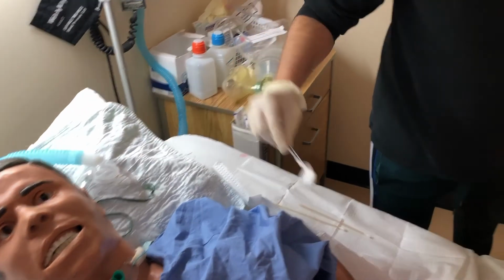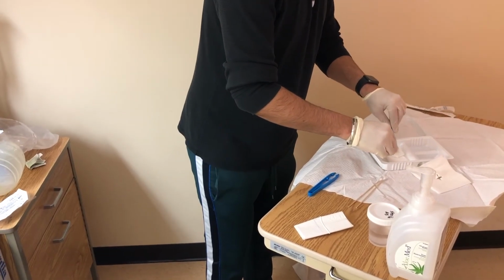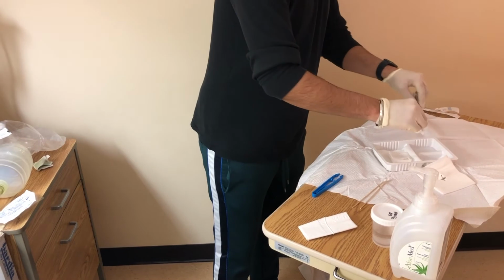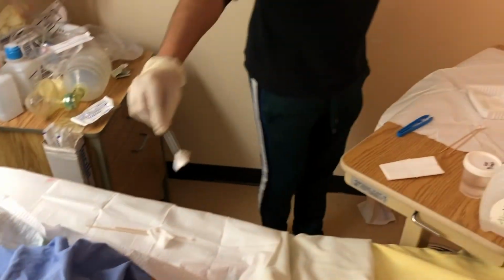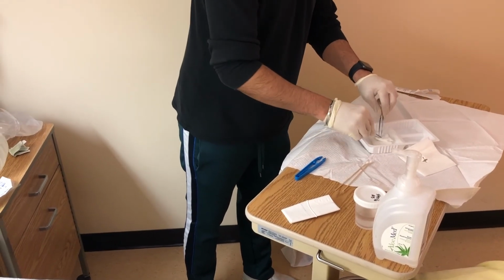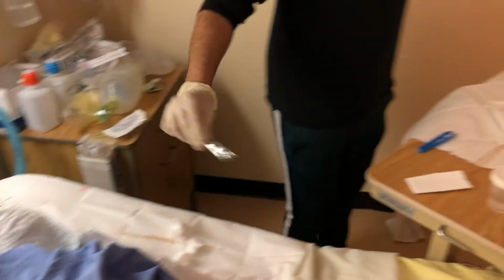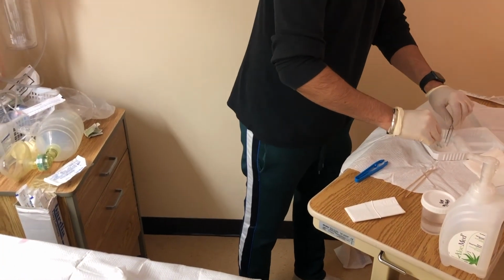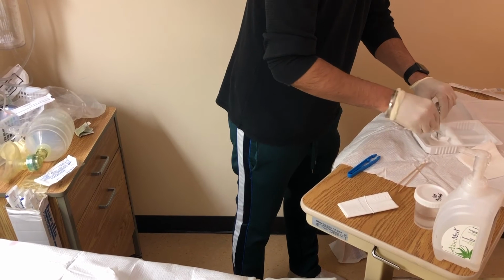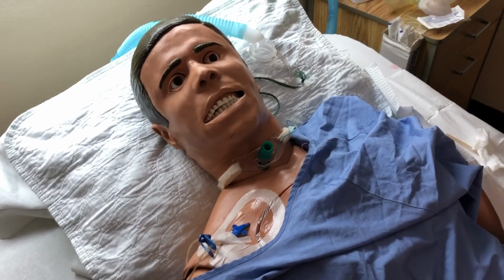Swab over top, discard. Do the same here. Swab underneath, discard. And now I can dry it. I would just dry this regularly, swab, done. And then I would do the same here. And then swab underneath, and that's dry.